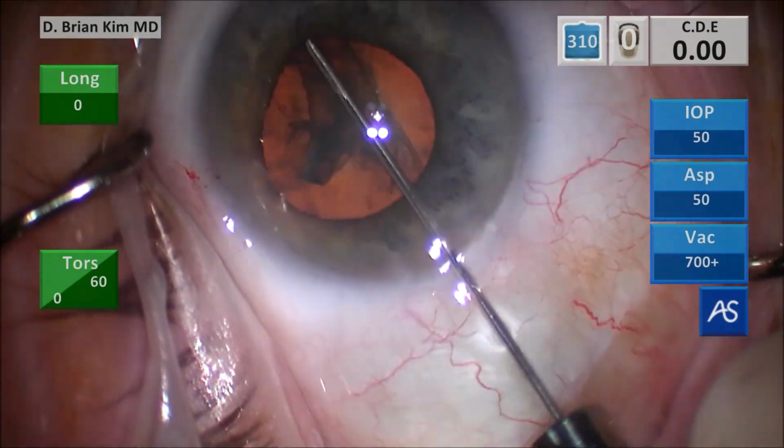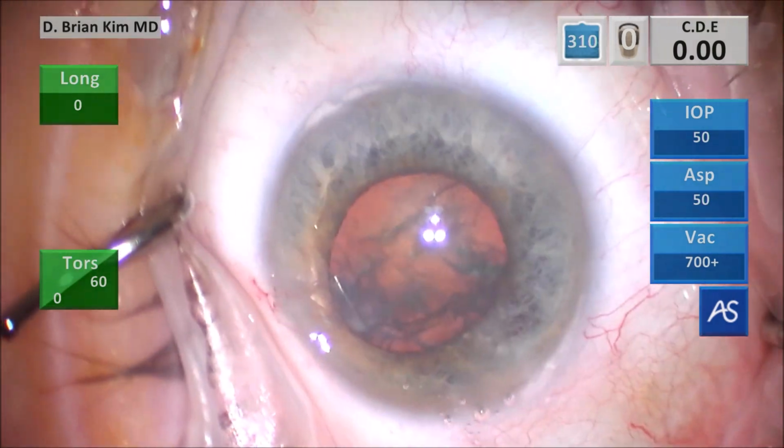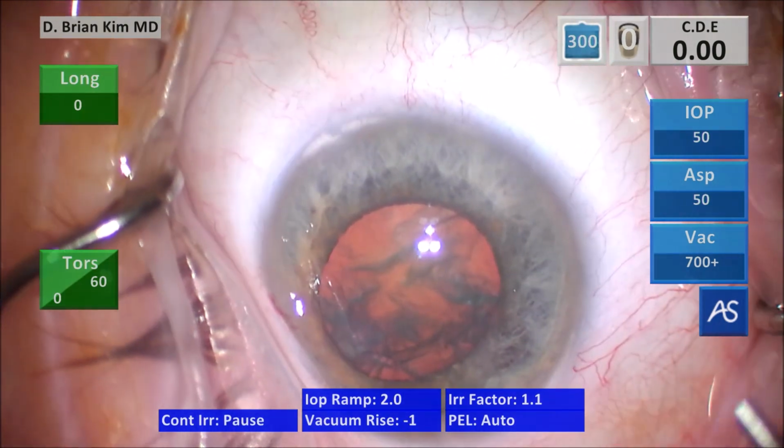You saw all that viscoelastic coming out of the incision. I stopped, and then I was able to spin the lens. So that's the key. You saw that viscoelastic, and you have to be mindful of the iris coming out. And if you start to see that, you've got to stop with the hydrodissection.